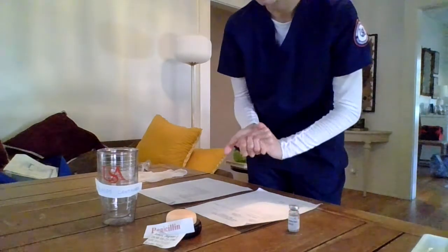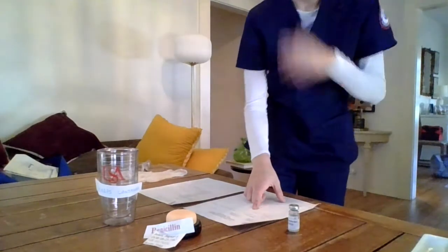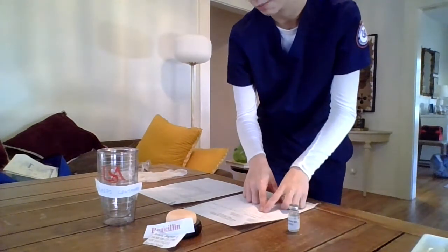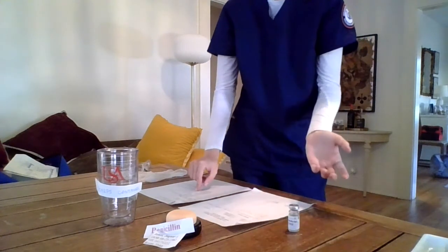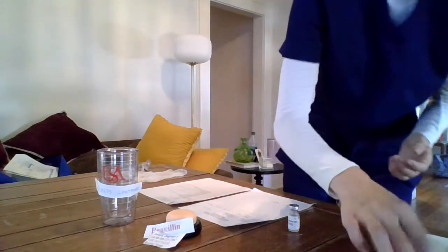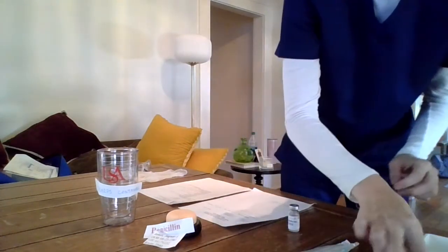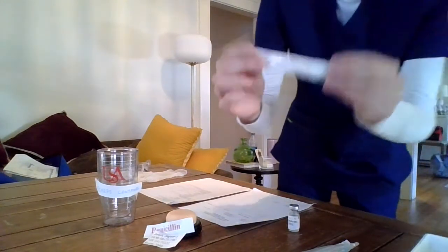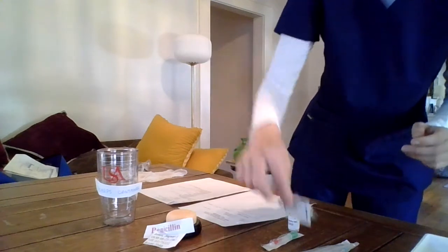I'm ensuring that I have the right time for administration, so we have every 12 hours. Verifying my right route, subcutaneous. So for the subcutaneous heparin injection, you will need a TB syringe, a needle assist, and alcohol swab pads.